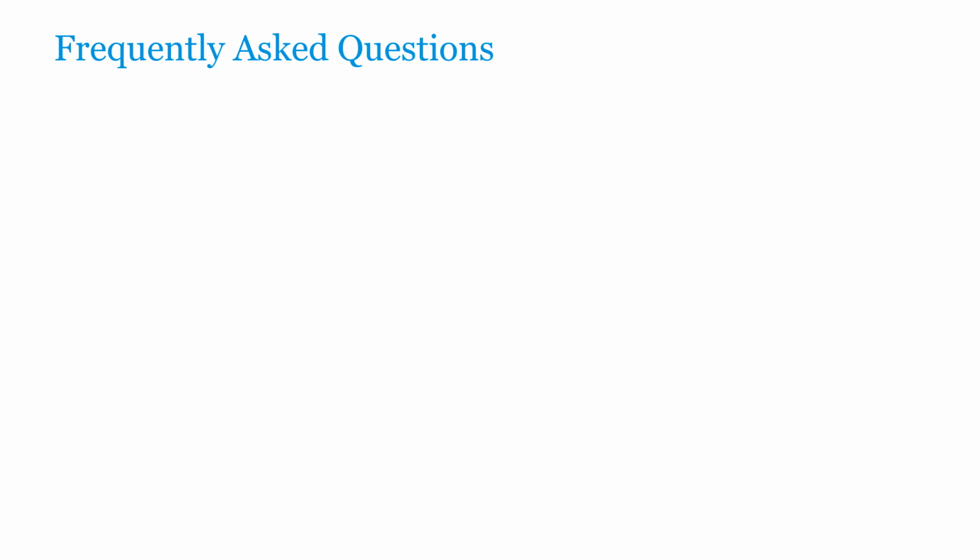Okay, about the sensor and change of the sensor every 15 days, and the cost, I think this is a very common question. Some patients start to use more than 15 days, up to 1 month, and say that the results are good. What is your opinion? So actually this is somewhat of a surprise if they are able to activate the sensor up to 1 month. The sensor is designed to stay for up to 14 days. It will automatically shut off.